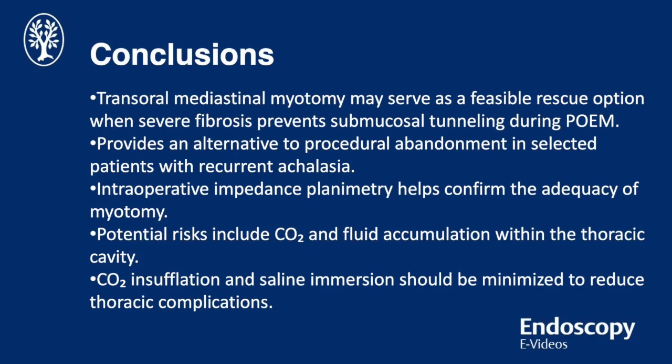In conclusion, this case shows that transoral mediastinal myotomy is a feasible rescue option when severe fibrosis prevents submucosal tunneling during POEM. Impedance planimetry helps confirm an adequate myotomy. To reduce thoracic CO2 and fluid accumulation, CO2 insufflation and saline immersion should be minimized.